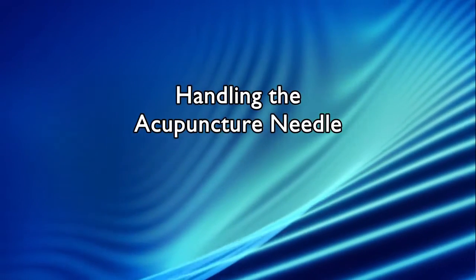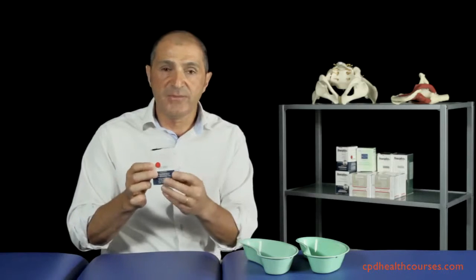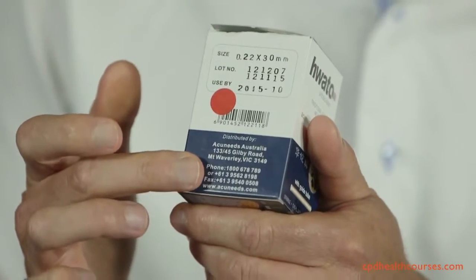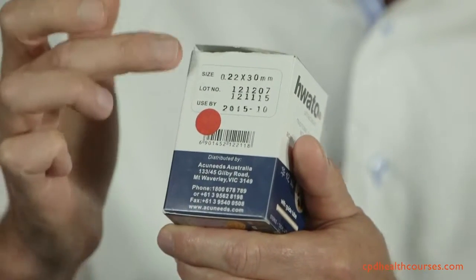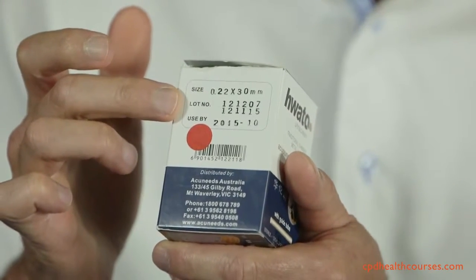To perform dry needling, I need to show you how to remove the needles from the acupuncture box and prepare them for needling. So let's have a look at the acupuncture box itself. This is a typical acupuncture box, and on the outside of the box it's got the dimensions of the needles inside. What it says on this box is that the needles are 0.22 times 30 millimeters.